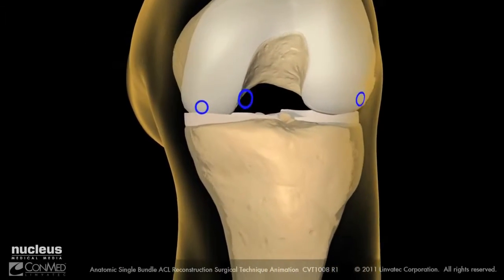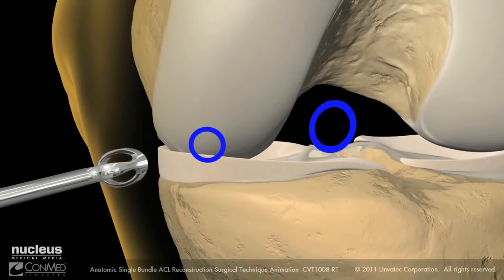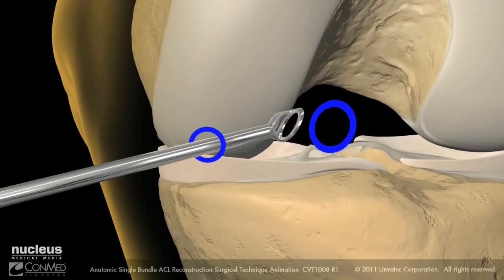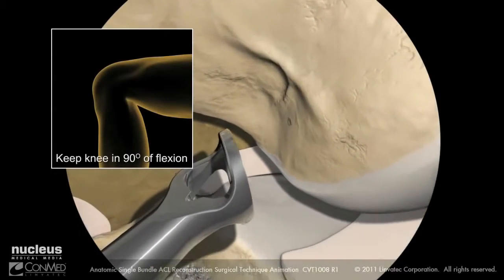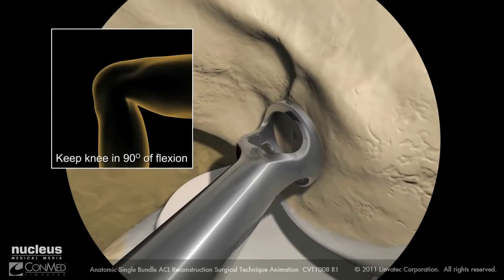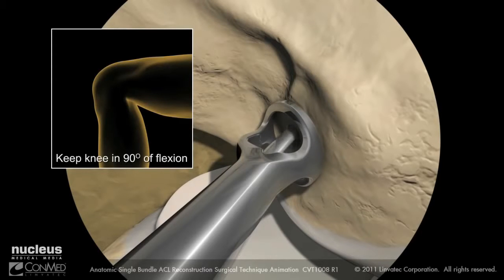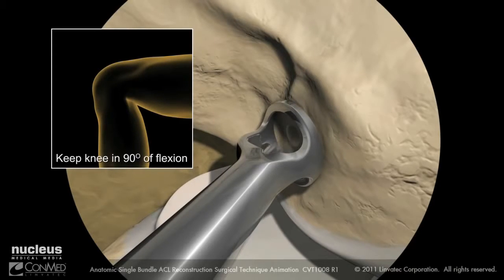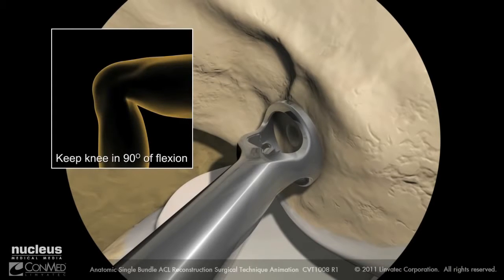With the ACL footprint identified and the center marked, insert the bullseye femoral footprint guide into the accessory anteromedial portal with the knee flexed at 90 degrees. Place the guide at the center of the ACL footprint. Once the correct position is achieved, advance the guide pin into the femur a few millimeters to notch the bone. Back the guide pin out to check that it correlates to the mark made earlier at the center of the footprint.